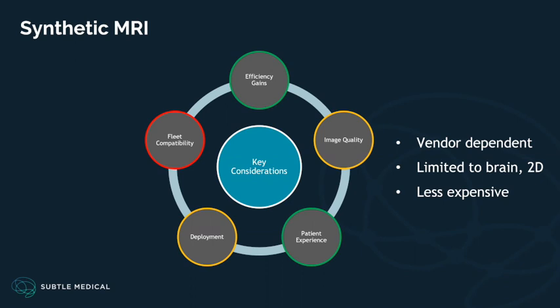Obviously there are more advances from a research perspective, and these techniques will actually only grow in the future. It is less expensive compared to some of the hardware solutions, being a software-only solution.